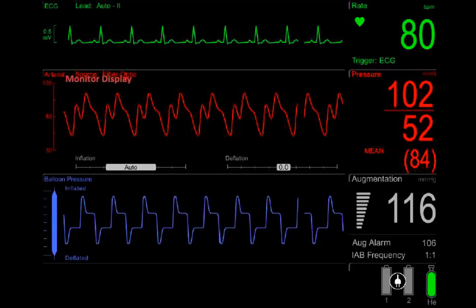So in many intra-aortic balloon pumps, you end up with an equal ratio. But that's not the standard. Like I said, maybe 80 to 90% of the machines will use the area under the curve divided by the number of heartbeats. But some of the machines, for simplicity, will use only the peak, the largest value and the smallest value, and divide by two, assuming that we have equal timing for diastole and systole, regarding the waveform. But in general, if it's a normal heartbeat, yes, the systole is much shorter. It's 0.3 seconds, I think, and the diastole is 0.5 seconds. So the ratio is almost one to two.